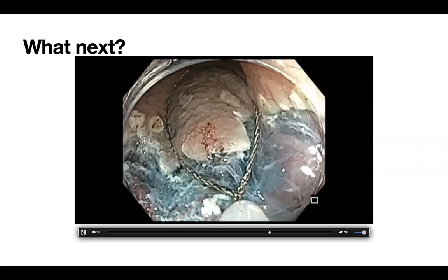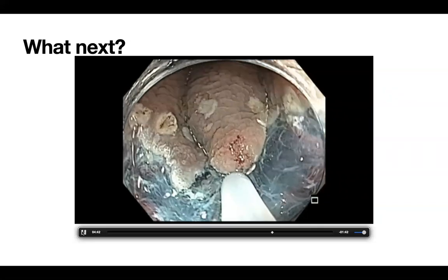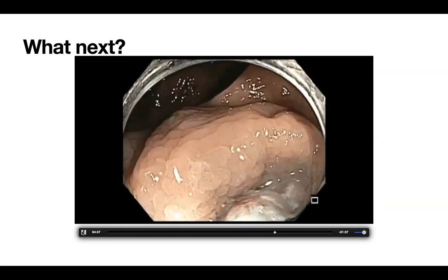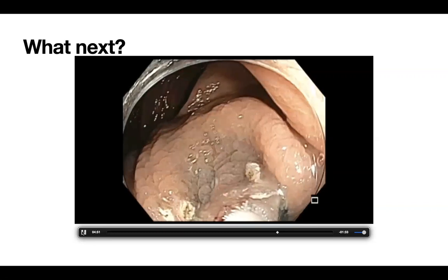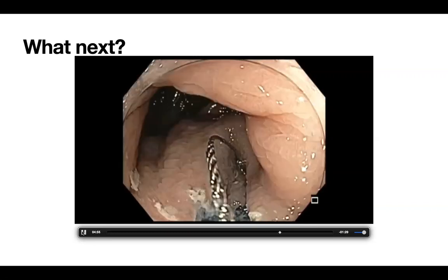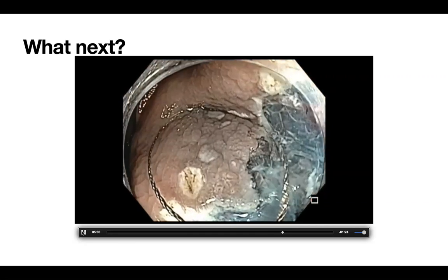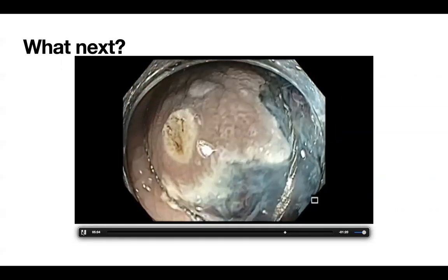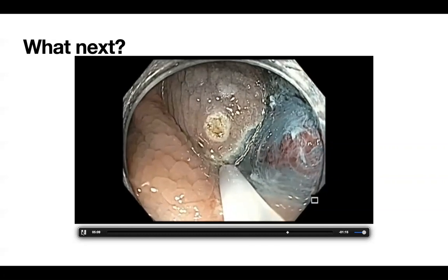That way, at least, if in case your needle is too deep, you're not going outside. And that's more of an issue if you are doing it in the colon, but not necessarily in the rectum. But you also have to keep in mind this lesion was located anteriorly. That means it is very close to the prostate. So whenever you're doing any resection, you have to think, hey, where is the lesion, so that you take necessary precautions, how far your needle goes in.